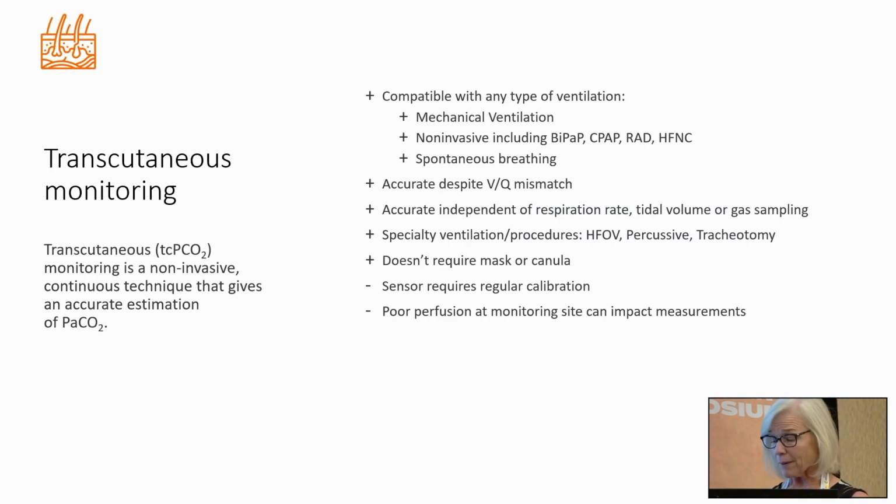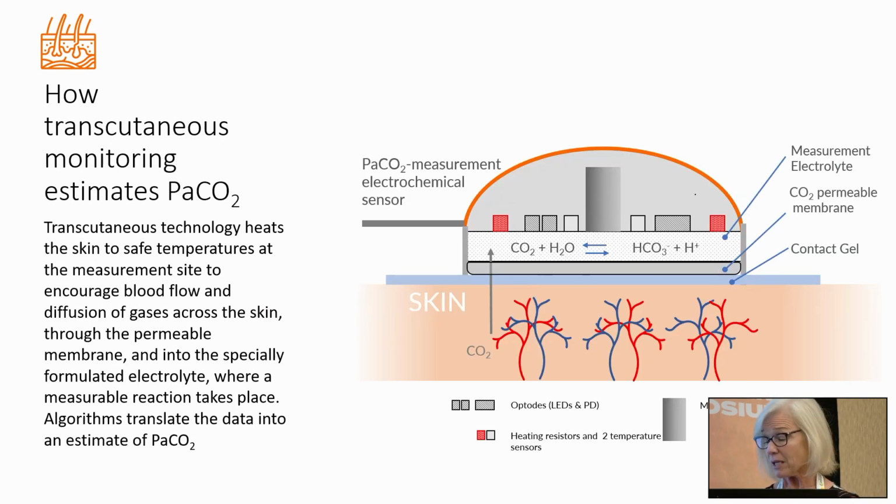So now I'm going to talk about transcutaneous CO2 monitoring. Of course, it's going to be accurate despite any ventilation perfusion mismatch, because we're not measuring at the airway, we're measuring what's diffusing across the skin. I'm going to tell you how it works. Are any of y'all familiar with transcutaneous CO2 monitoring? Does anybody use it? Just a few people, and then some of y'all are familiar with it?